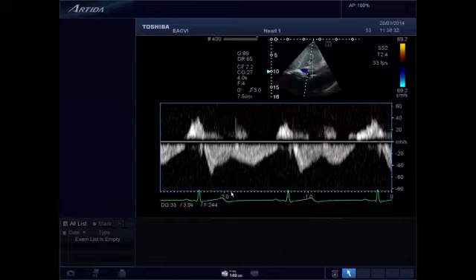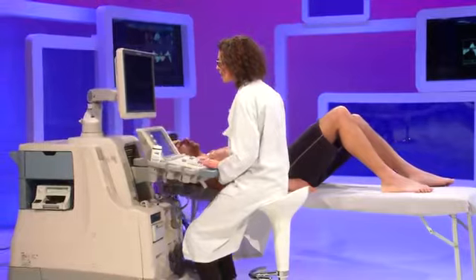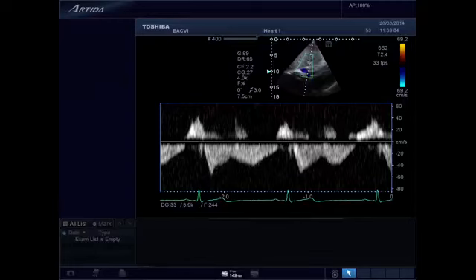The principle of the acquisition is the same as for the pulmonary vein. You have to check where the hepatic vein is with the color Doppler, then try to be parallel, and then start the pulse Doppler modality. Without the high PRF, you have to be in a low PRF modality. So here you can see the systolic wave, the diastolic wave, and the A wave of the flow. And it's sometimes useful in order to estimate the right atrial pressure.